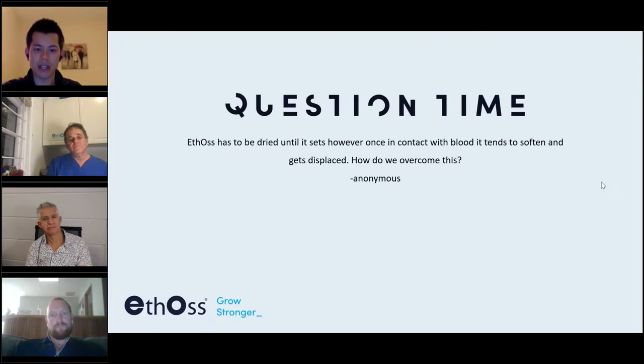And of course, actually, it delays you. So me and my nurse have a bit of a joke where she's always saying, "Johnny, you're very impatient." But unfortunately, you just have to take your time. So raise the flap, try and release the periosteum as much as you think you will need at the beginning. And also, local anesthetic has adrenaline in. That's also a good vasoconstrictor that can help. But otherwise, you've just got to be patient, compact it down.